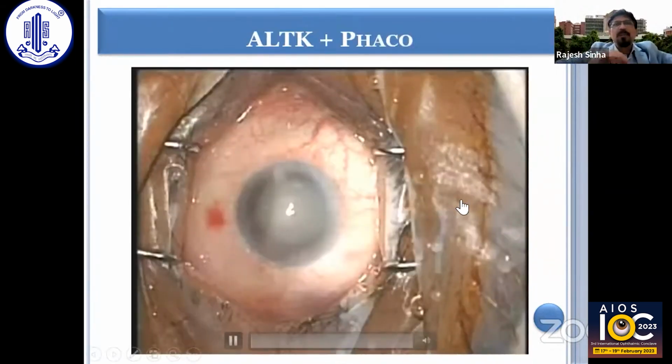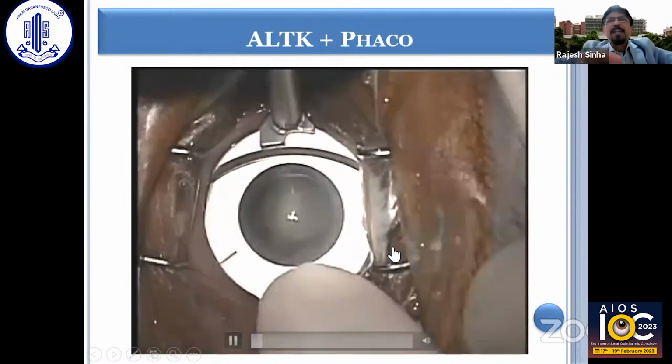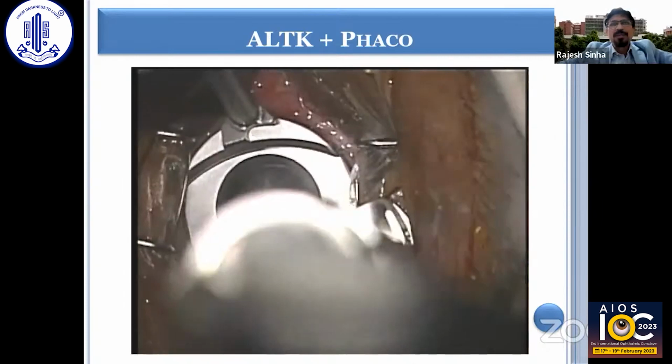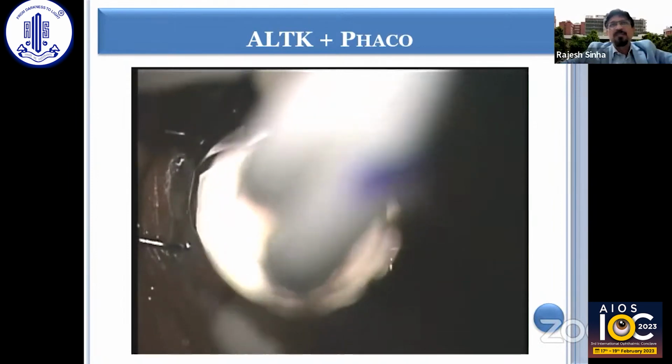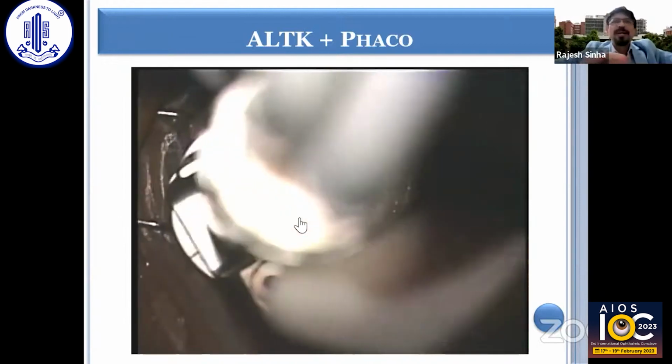You can also combine it with a phacoemulsification in cases of, say, bad trachomatous keratopathy. In such a case, with the help of the microkeratome, you can clear the visual axis quite significantly. And once you clear it well, you can see how well it looks now.